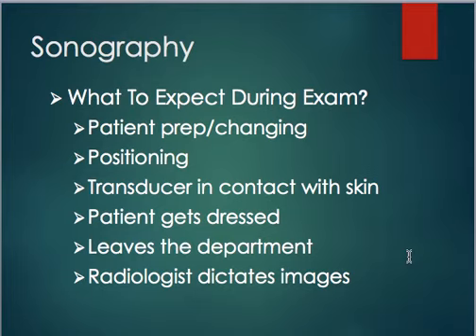Positioning is a little bit easier as far as patients. They need to be lying down most of the time on the stretcher. They can lie on their back or on their side. We might have them move from their back to their side just a little bit to be able to position a little bit better to get the transducer in the area or region of interest. The transducer does have to come in contact with the skin. You have to use the gel, so that can make a difference whether it's cold or warm, and how that feels during the exam. After the technologist goes through and scans the anatomy, then the patient just has to wipe off the gel and get dressed.